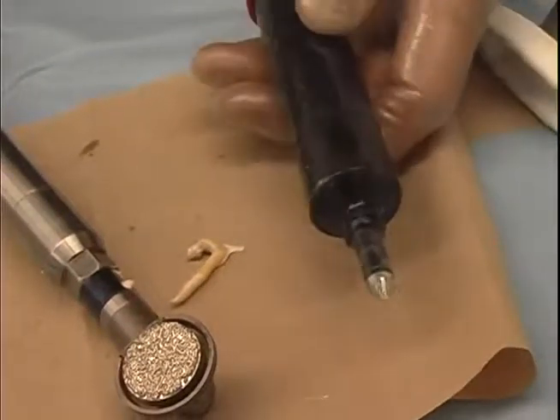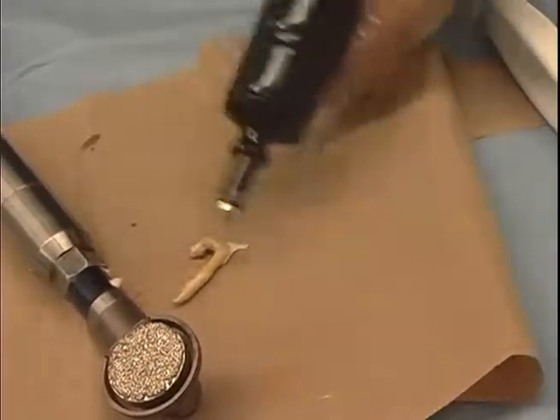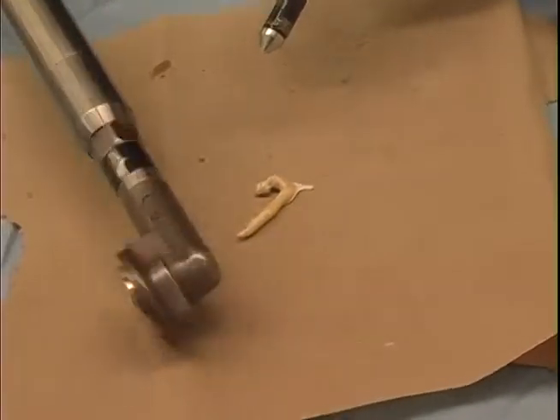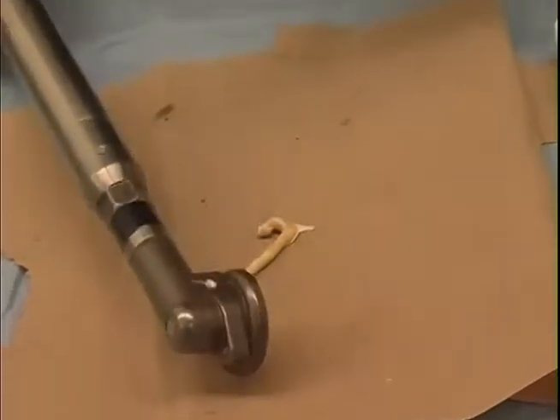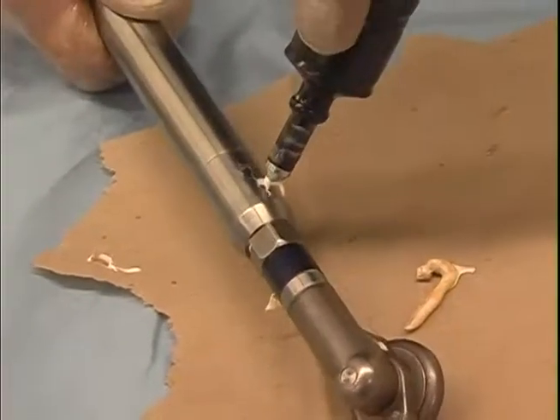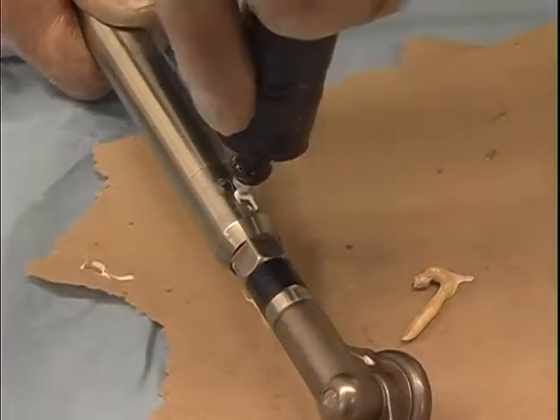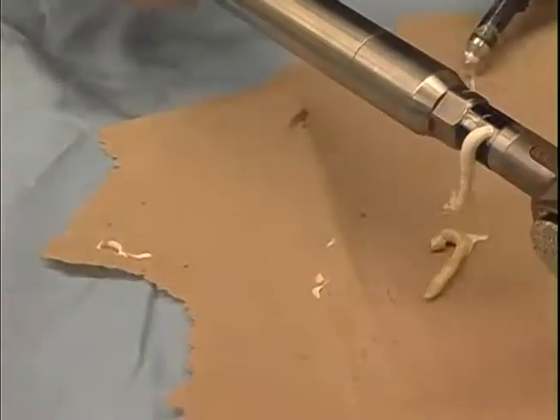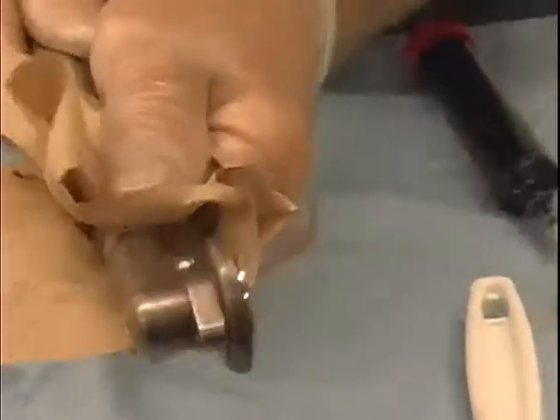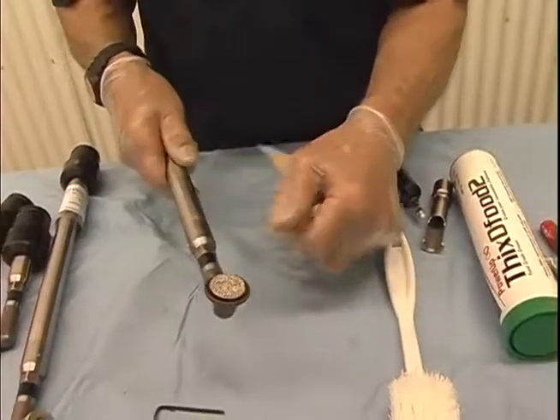It took a minute for this gun to get primed, but now it is primed because this is a brand new gun. And you can see the grease exits out of the port there. Now I'll grease this part. And you can see the grease exit out of the port. Simply clean it up, and the procedure is done.